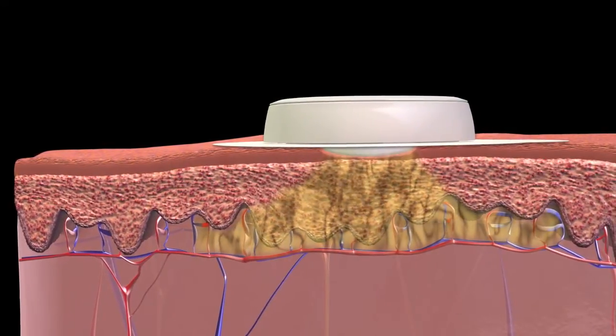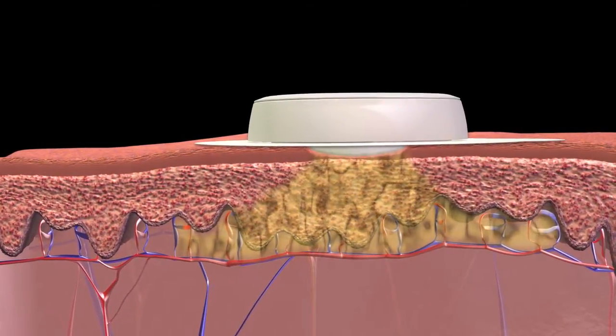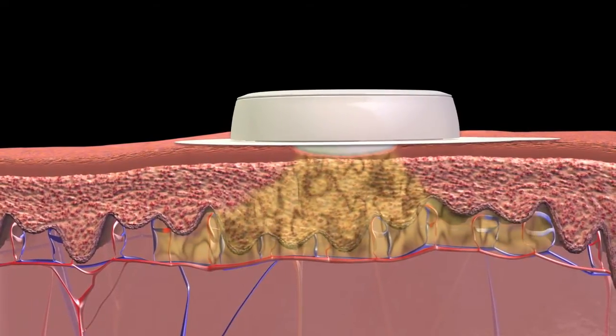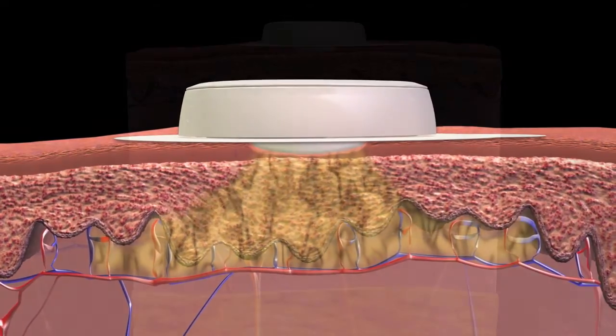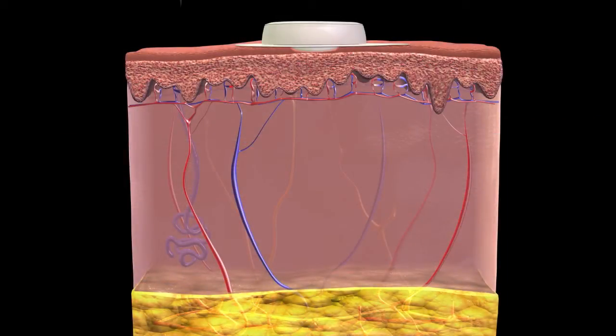Symfony measures interstitial glucose levels using glucose oxidase, similar to other commercially available glucose monitors and lab analyzers. Some sensors require needle insertion into the subcutaneous area. Symfony's non-invasive approach does not require a needle.